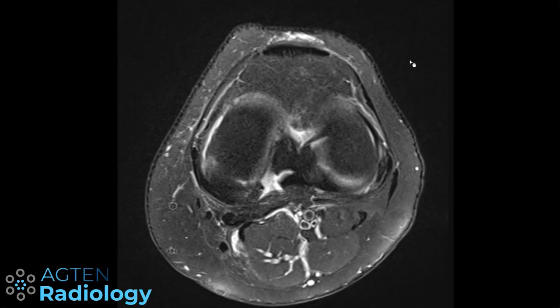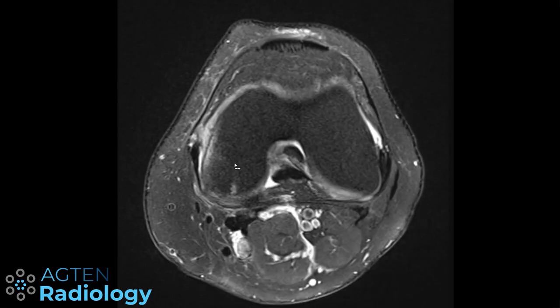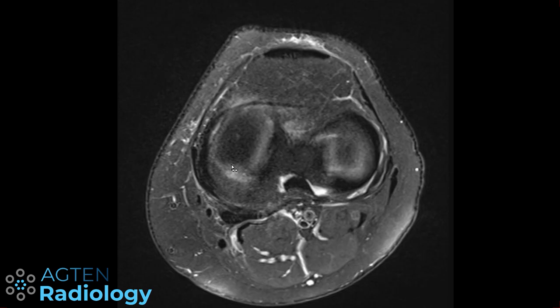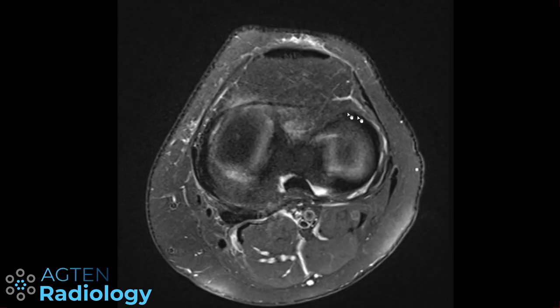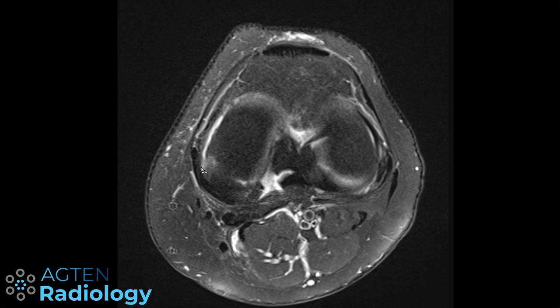One tip here is to always also have a look at your axials, because you can nicely see the radial tears and root tears here as well. So here we are at the level of the joint. We can nicely see parts of the lateral meniscus and here parts of the medial meniscus. If we scroll through, we can see that the meniscus here comes to an abrupt end and we have this gap here. Basically, the root should attach here just next to the PCL.